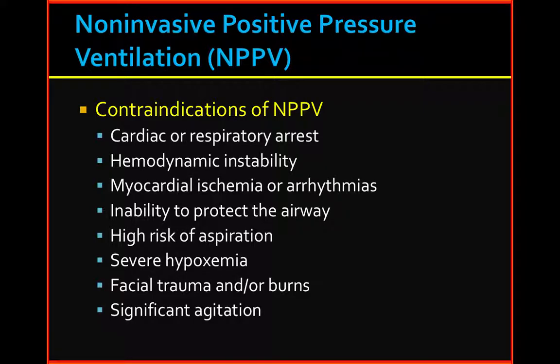What could happen here, let's for instance say, in a pressure control situation where you're giving a specific pressure, if the compliance of these lungs somehow drops precipitously all of a sudden because of some pathology which we'll get into, you will notice that the volumes will drop. You would want to know that, and so you could set an alarm on the lower side of the volume so that if the volumes did go down, an alarm would go off saying that you're not ventilating.